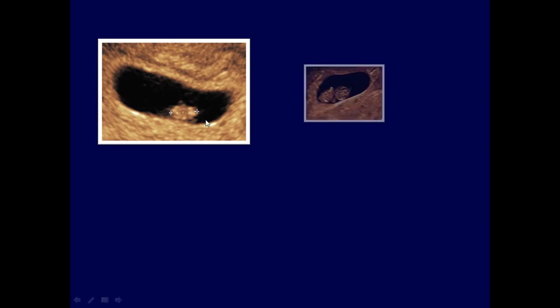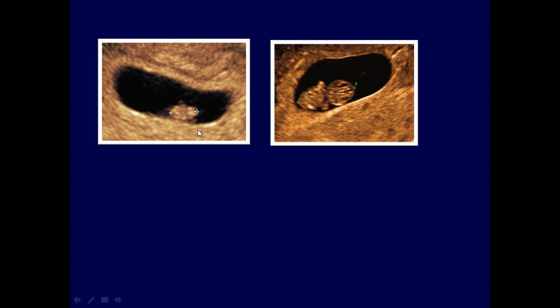This is an embryo at 6.5 weeks. It is difficult to differentiate between the crown and rump. This is another embryo at 7.5 weeks. This is the head. These are limb pads. Here is the torso. Calipers are placed at the top of the head and at the bottom of the torso.